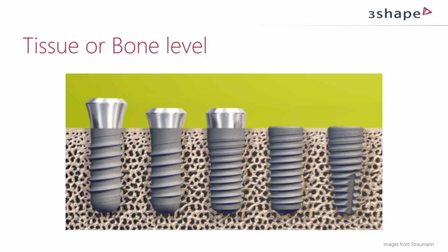So manufacturers can say that, okay, if I have this roughness or this groove or this surface, I can expect osseointegration and primary stability after 2-3 weeks, and others say after 5 weeks. So there is a big variation and a big difference among the different manufacturers.